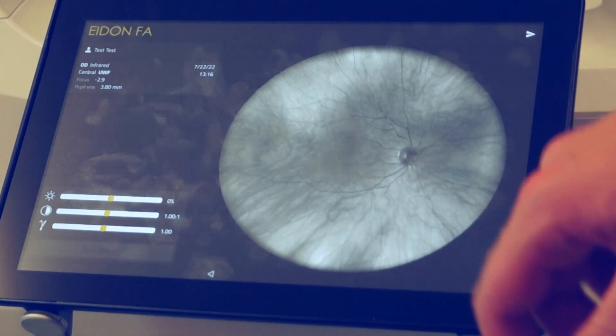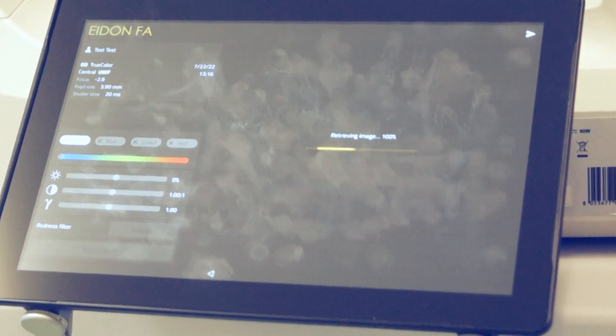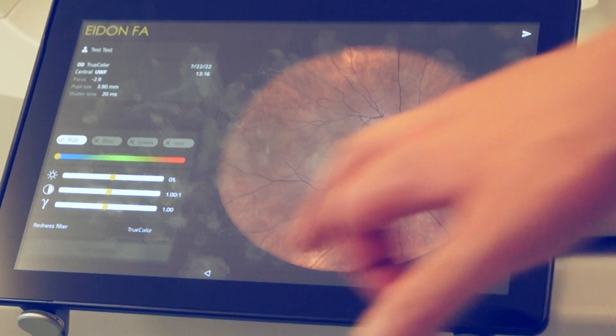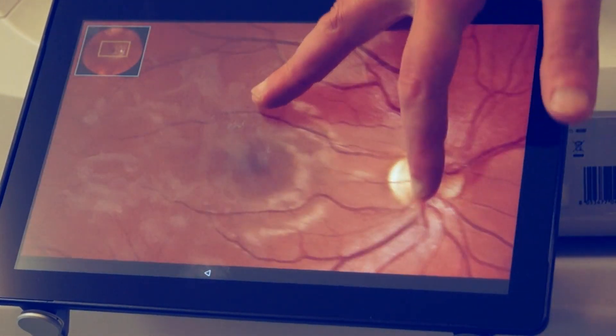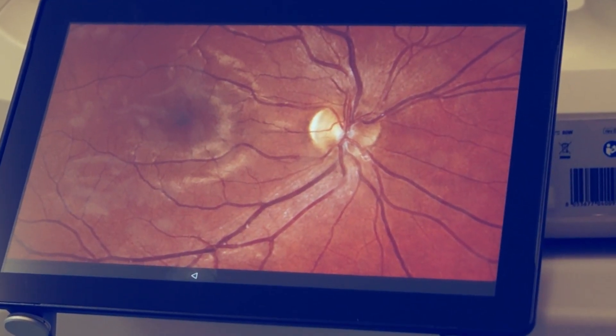This is the infrared — and let's see the color. What you can do here is change the exposure, gamma, brightness, and contrast. There are also digital filters like TrueColor Red Plus. You can enlarge the image. All of this can be done on the tablet.